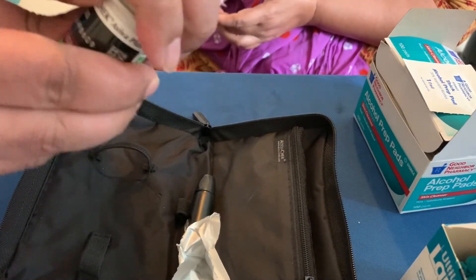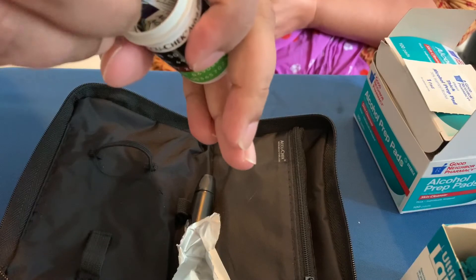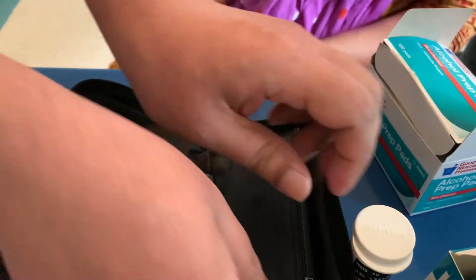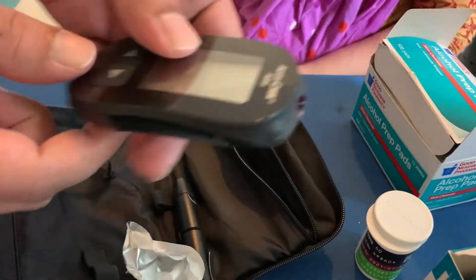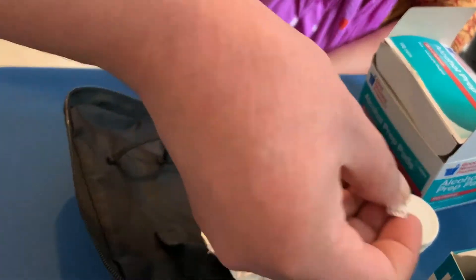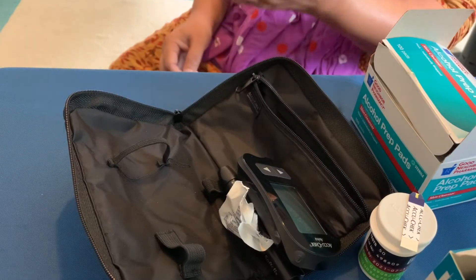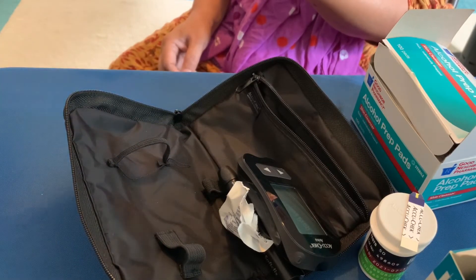You're going to use the test strip so that you can easily calculate the blood sugar count. This is the meter. Before you use the meter, you want to use that needle to prick — that's what I'm doing right now.